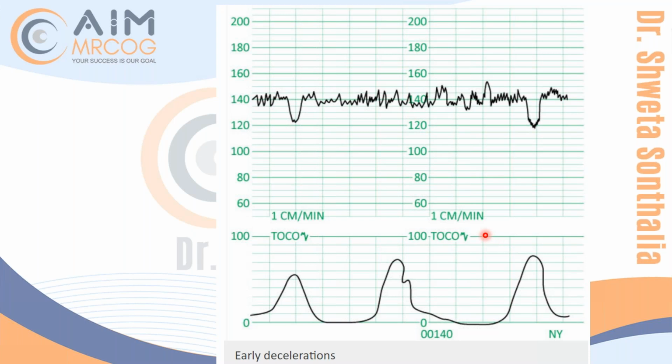This is for teaching purpose. When you see the actual CTG, this is not an actual CTG, because in an actual CTG the image doesn't look like this. This is a made up CTG to show you how it looks. You get my point. When you see the real CTG, you will understand how difficult it is to interpret things. This is just for training and teaching purposes, so don't take it as an acute drop and acute up.